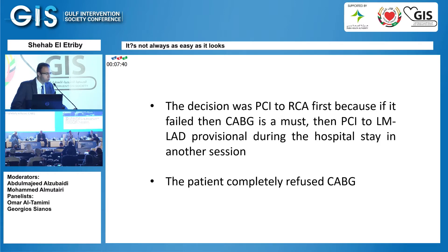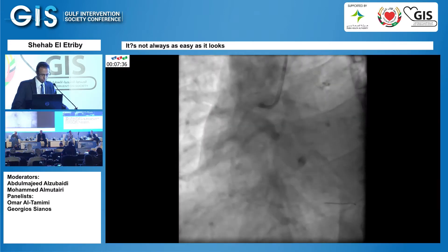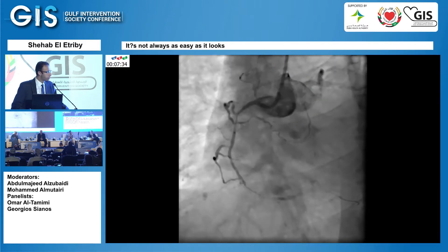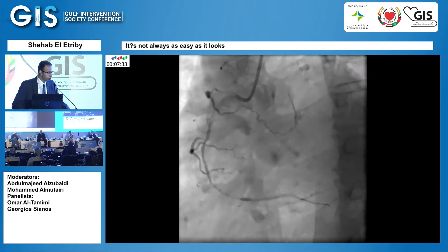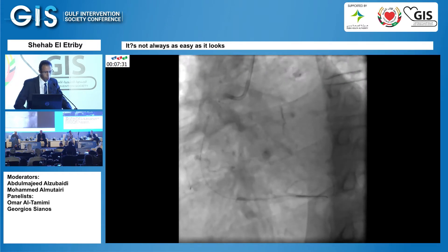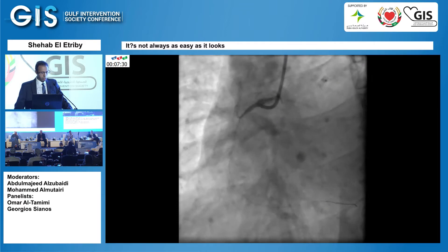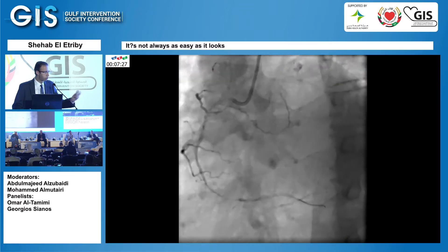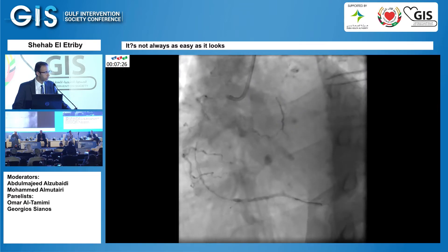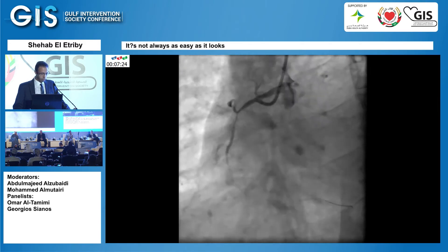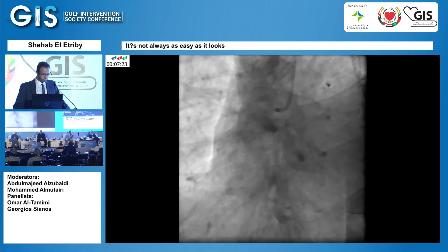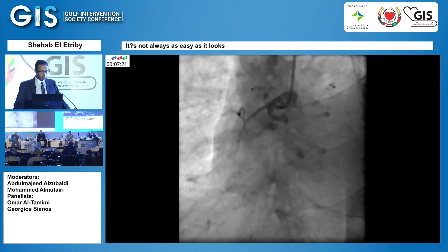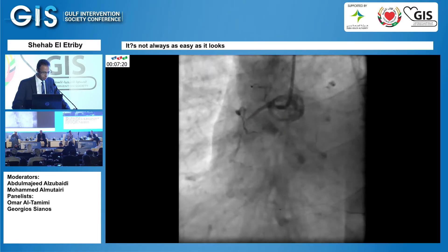The rationale was: if we fail to do the RCA, there is no point doing the left main and leaving the RCA. If we failed in the RCA, he would have to undergo CABG. I passed with the Pilot 200 wire — that was the wire we had — and it passed smoothly. So I thought, okay, that's easy, I'll go with the balloon and finish everything easily.